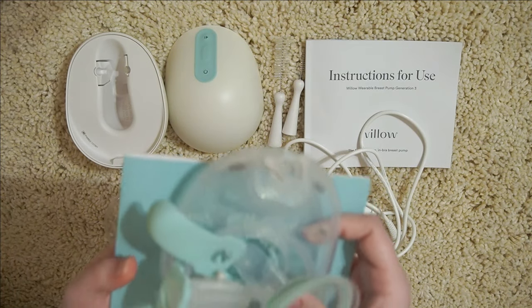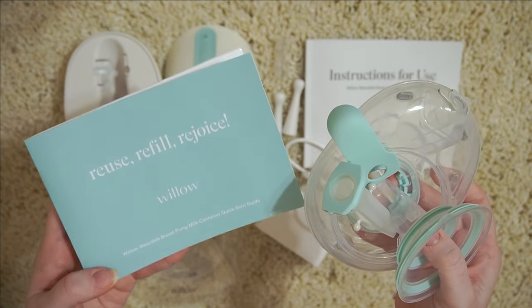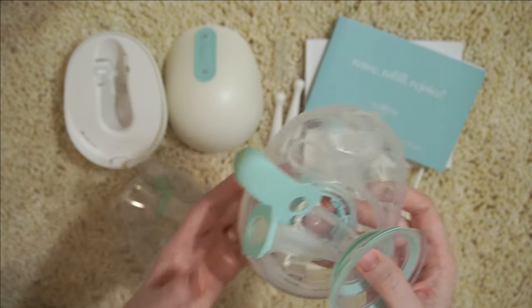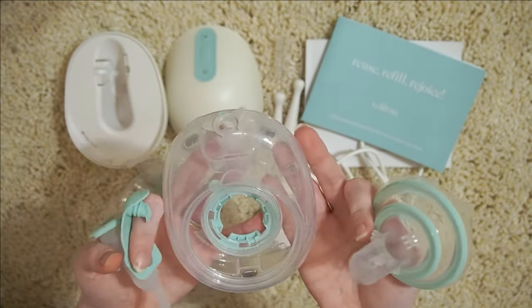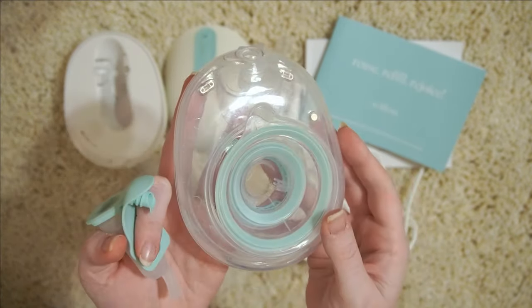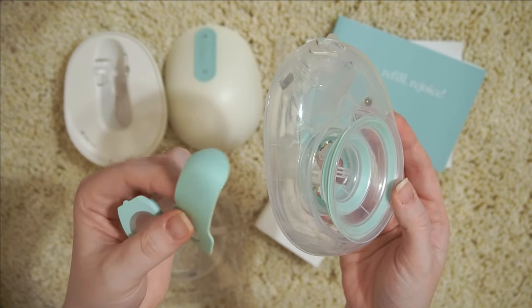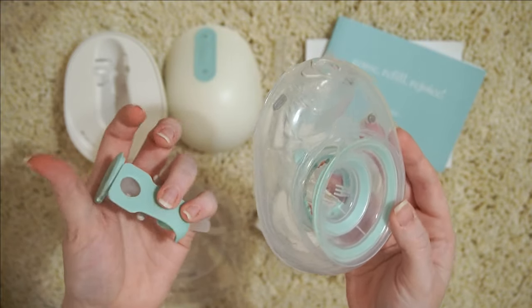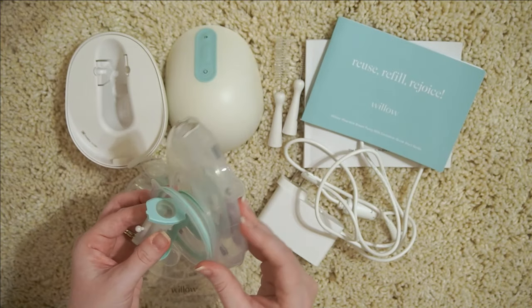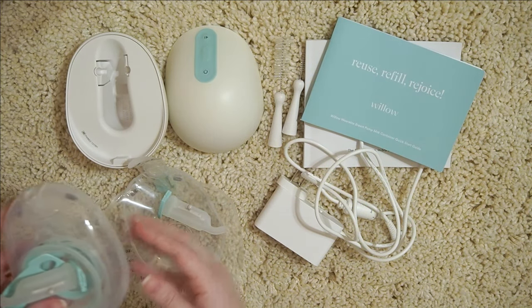Also sold separately, they do offer a reusable container. When you order that, you will get a manual to learn how to assemble it, how to use it, the ins and outs of it basically. And then you have all the parts for the reusable container: the container itself, a little flange piece, another flex tube, and also something that goes on top to seal everything. It may look like a lot, it may look complicated, but once you do this a few times, it's not hard at all — it just kind of becomes something that you do to get ready to pump.